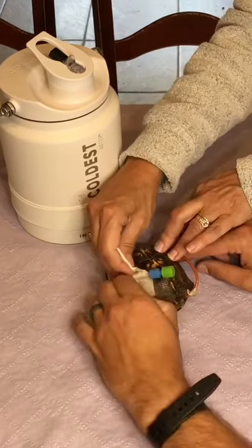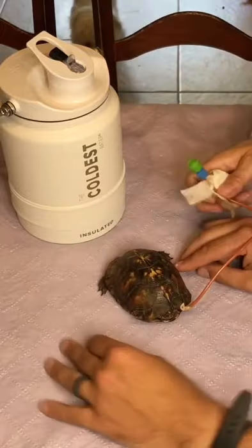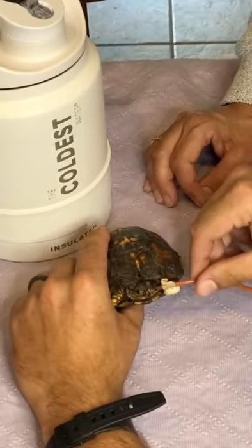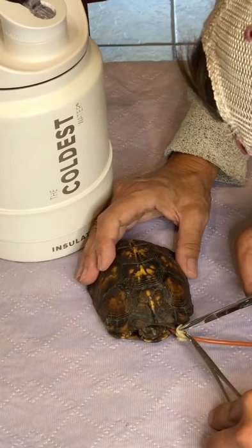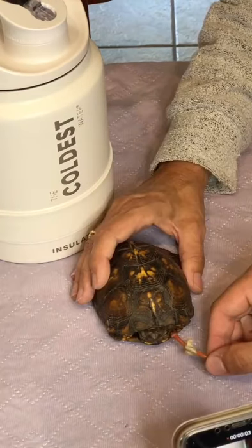Today is a big day for Tilly the turtle. She is maintaining her weight and so it's time to remove her feeding tube. First, what we will have to do is remove the stitches that are holding the tube in place. Now that the stitches are removed, we can now remove the tube.